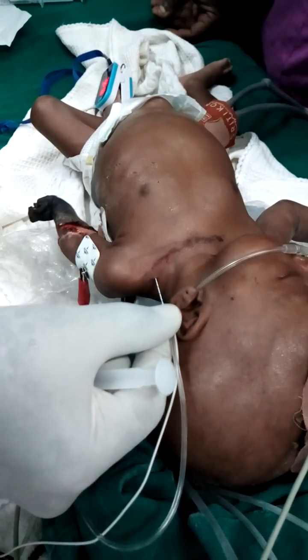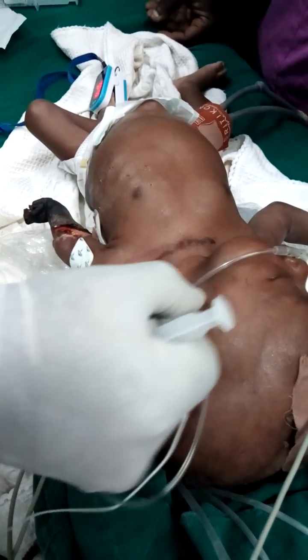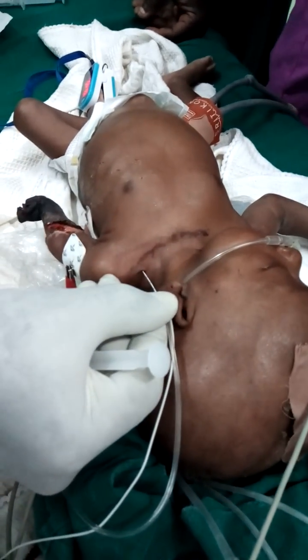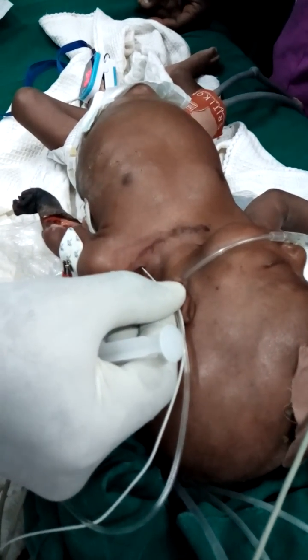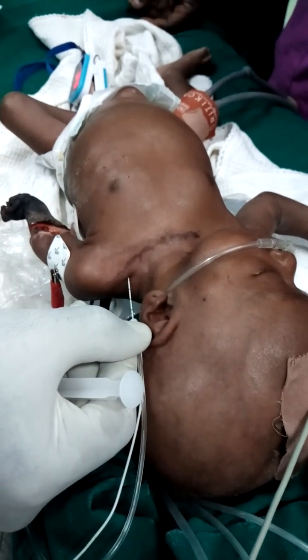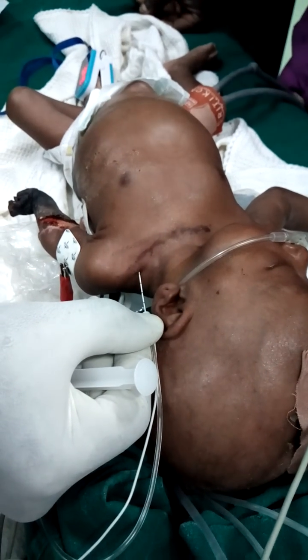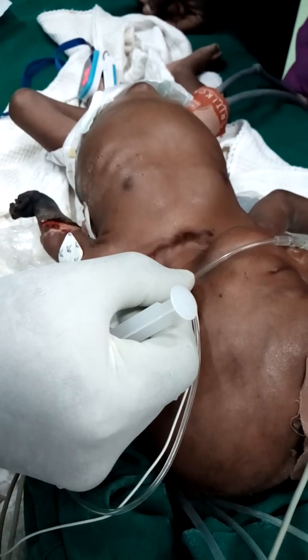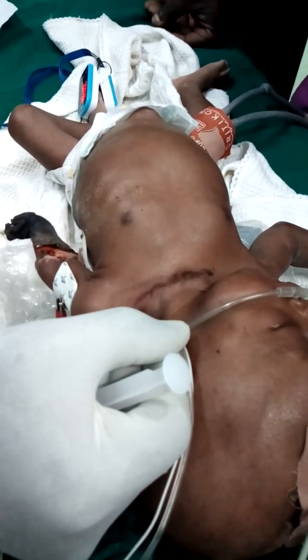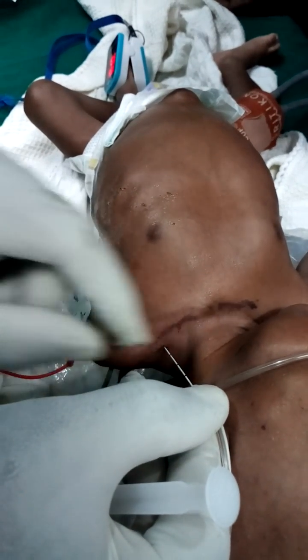We need to reposition — I've missed it. Can we reduce the current to 0.8? Stop moving. We can see the flexion movement, which shows that we're on the brachial plexus.